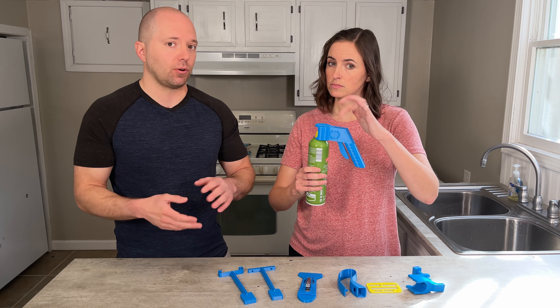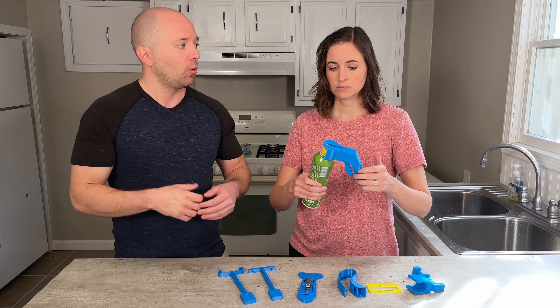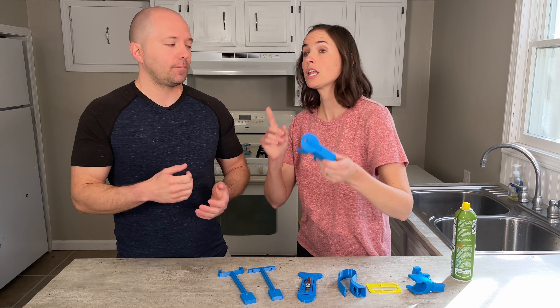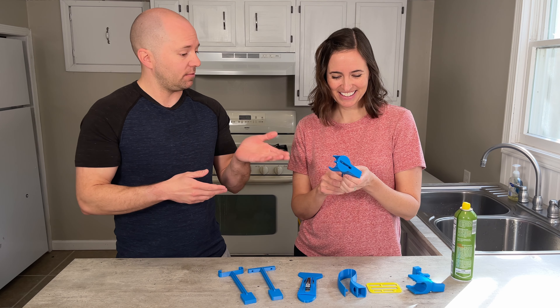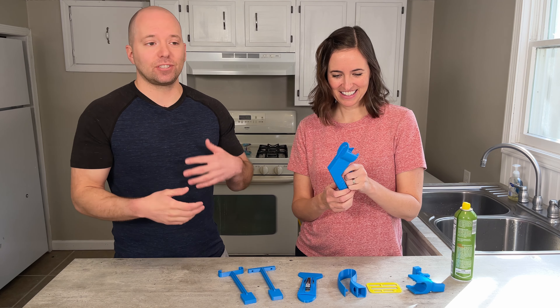So let's say you've identified a place where you want to have your model printed, or you're going to try it yourself — the next decision you need to make is what kind of plastic filament to use. Filament is just another name for the plastic wire used in 3D printing. And of course, what pretty color — every color of the rainbow — it's always important to have the right color! This one here is our nice EquipMeOT blue.